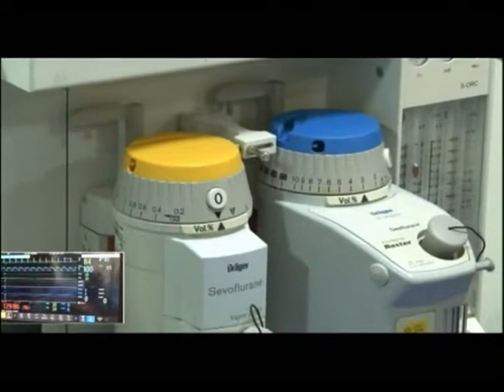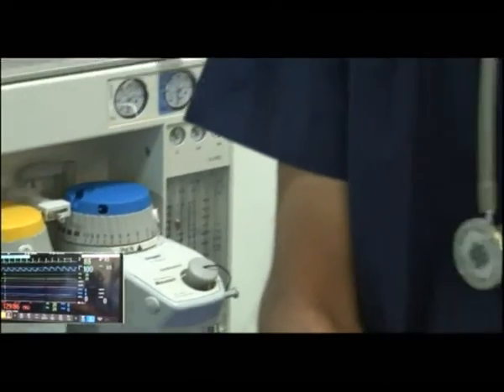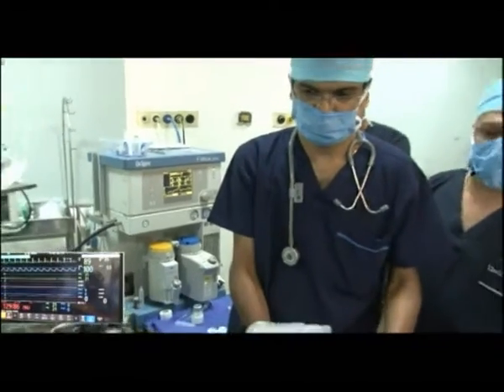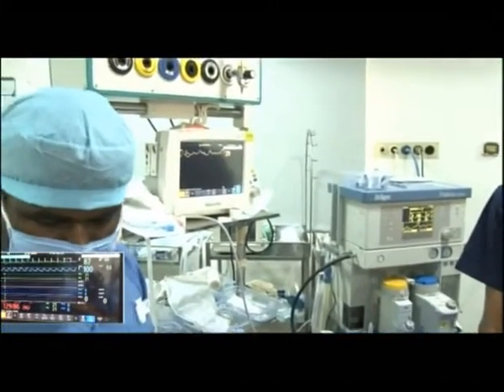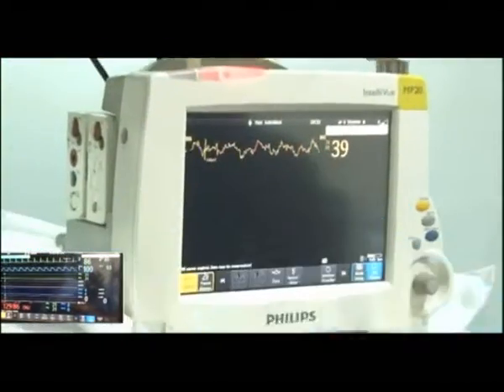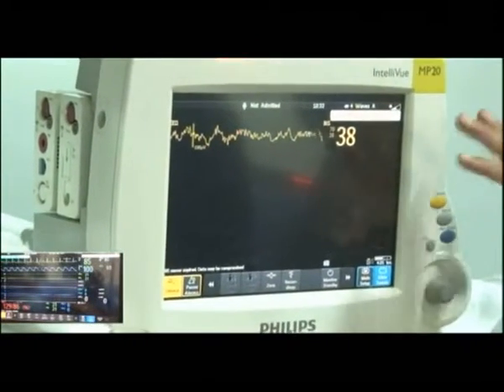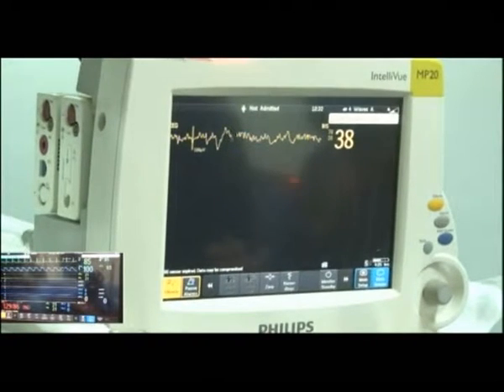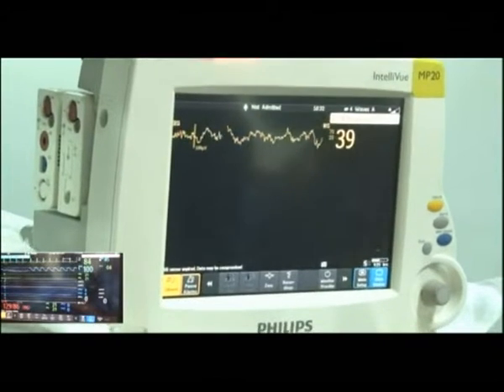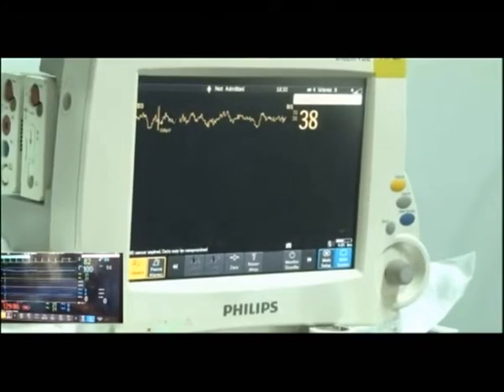There's a reason why I'm using 3% and not more. In the old days, we used to have a higher concentration of inhaled anesthetic, whether it be sevoflurane or desflurane, and typically we would have about 1 whole MAC. As you see, the sleep dose of propofol brings the BIS down to 35 in 95% of cases. And by giving half a MAC, all you're doing is, as the propofol is wearing off, the inhaled anesthetic basically comes on.